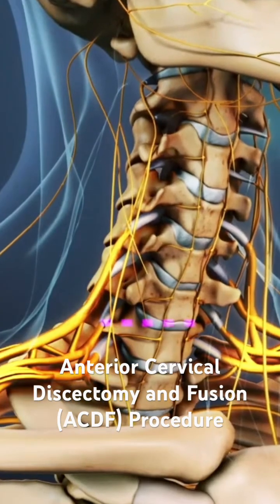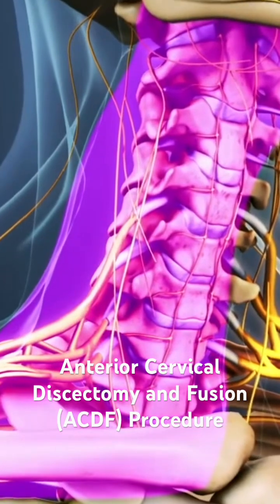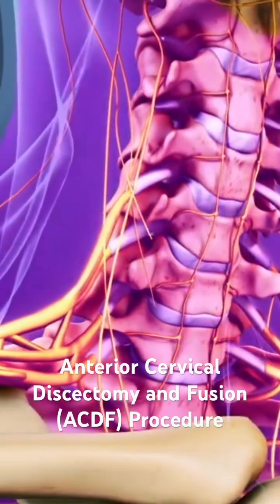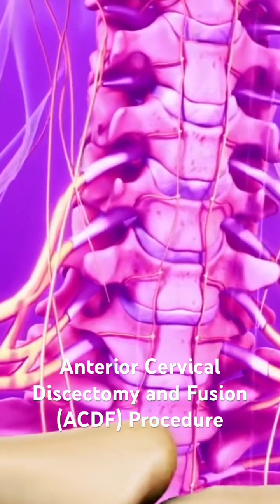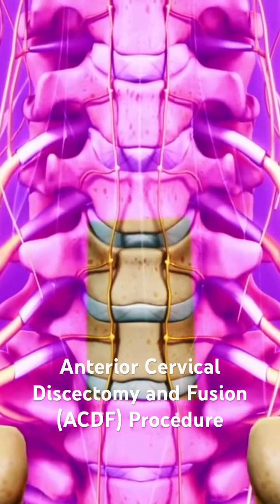This procedure starts with a 1 to 2 inch incision in the front of the neck. The thin layer of platysma muscle that lies under the skin is cut and moved aside. The prevertebral fascia, a thin layer of fibrous tissue that encases the spine, is dissected away, exposing the intervertebral disc.